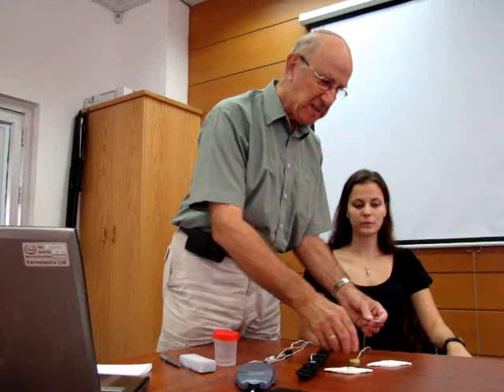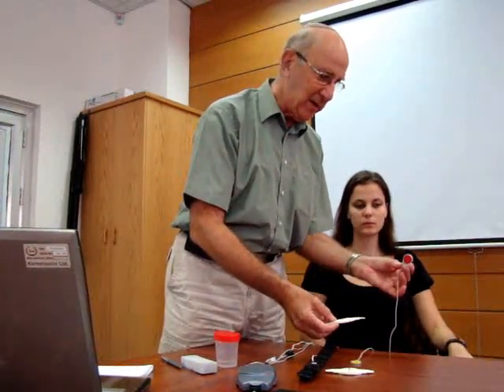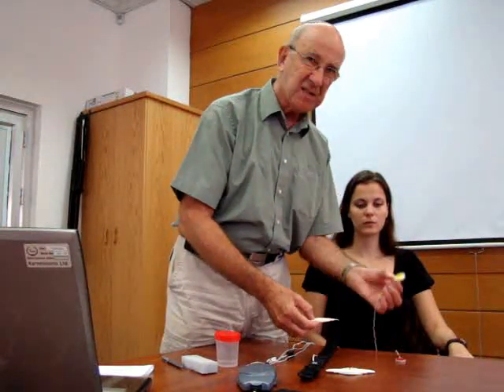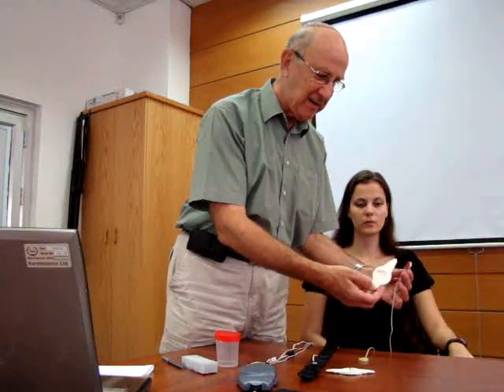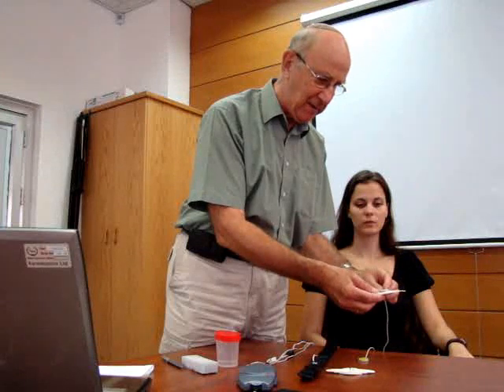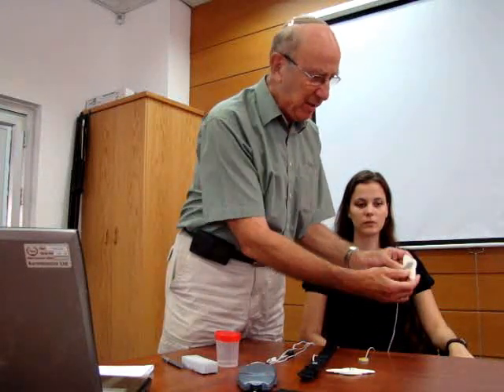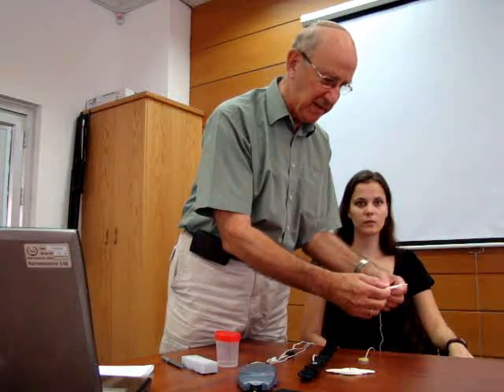I'll show you how to place the sensor in the adhesive acoustic pad. The sensors are color-coded. The red sensor goes on the trachea, the yellow sensor goes on the chest, and the color part goes inside the adhesive acoustic pad so that the plain side, which is the sensor side, goes next to the skin.